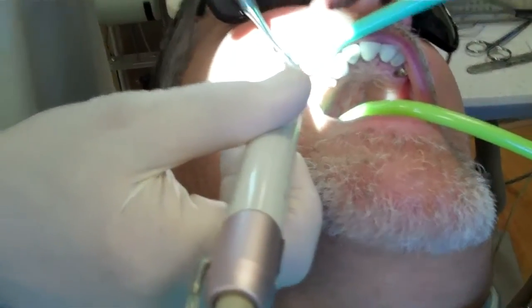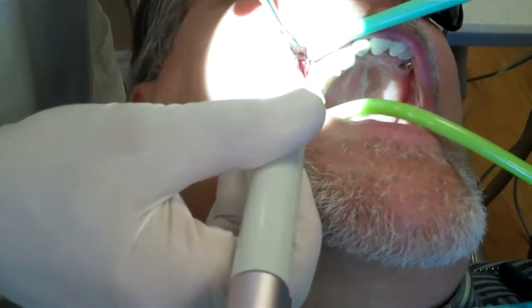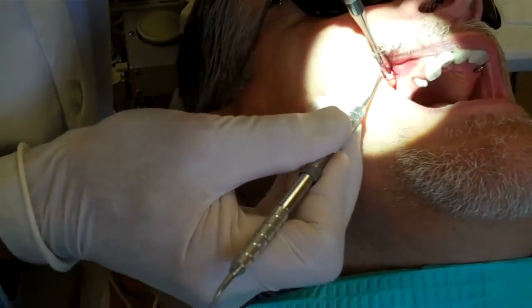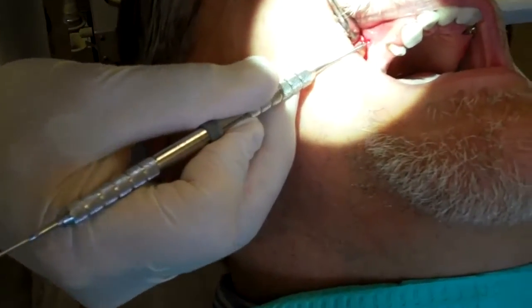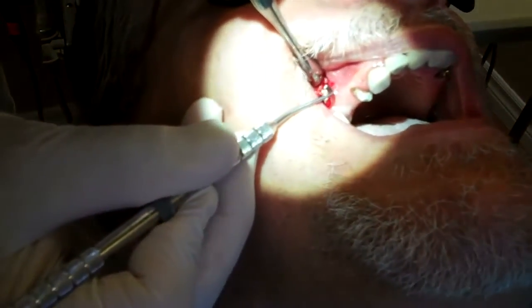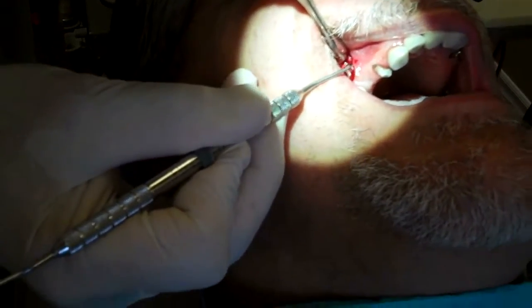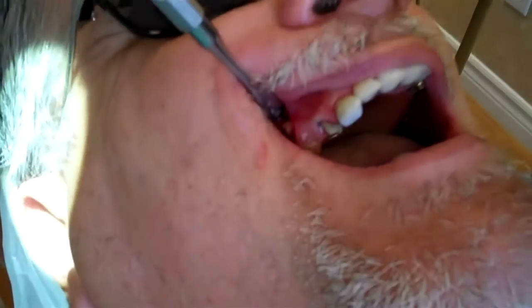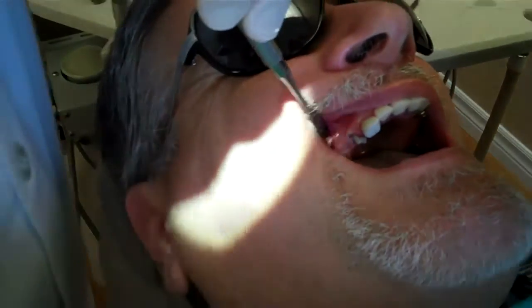Right in here, this is called a piezo scaler, and it's a physical instrument. Okay. So this is the material right here. It's called MTA. It's funny because it's almost like Portland cement. Yeah, sterilized Portland cement is what this ends up being.